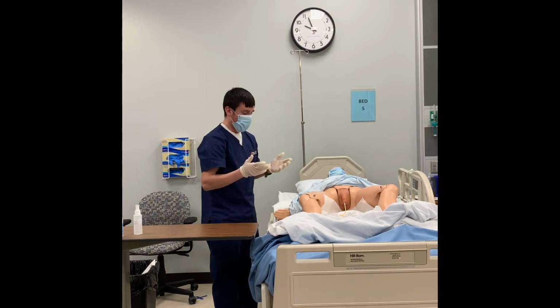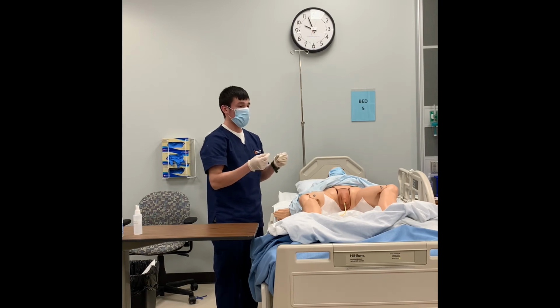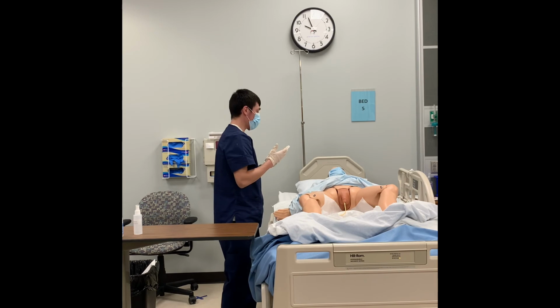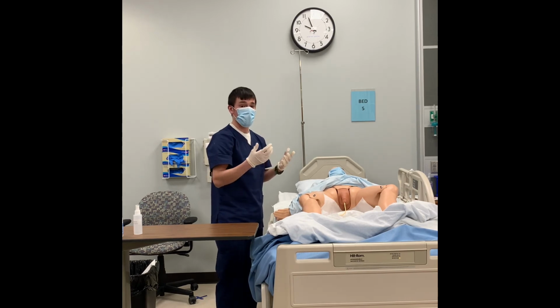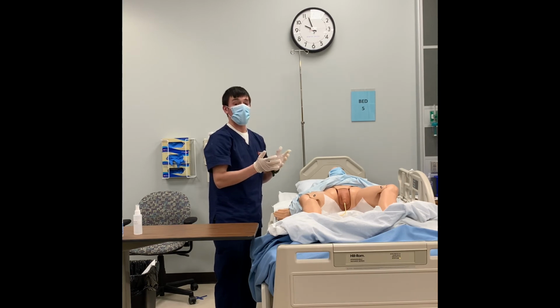Okay, so after that, we would clean everything up. We would cover him back up, make sure that he doesn't have any discomfort or any other concerns. Give him his call light, perform hand hygiene, leave, and document.